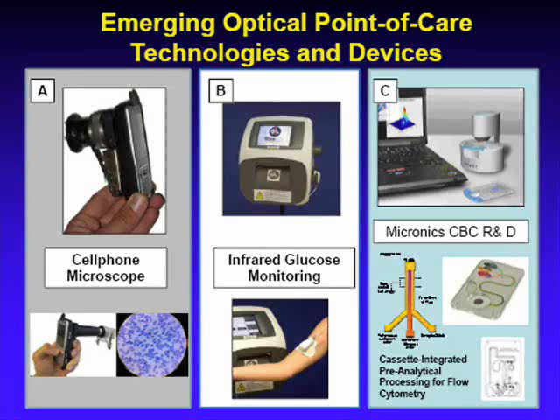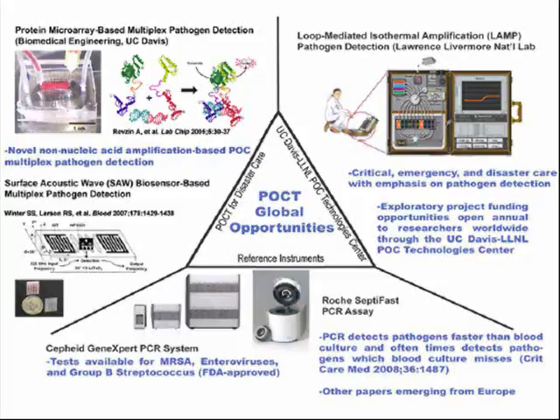Panel C is from a company called Micronics, and this is a card-based flow cytometer, and you can see how it's compared to a laptop. It's very small. The card is shown below. This is the actual card, where the blue or green, yellow, and red areas are the reagents. This mixes with your blood sample, and through cell sorting, you can then do your complete blood count more accurately and potentially do differentials if it achieves a similar capability as their larger counterparts in the laboratory.